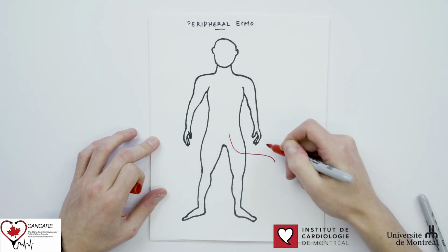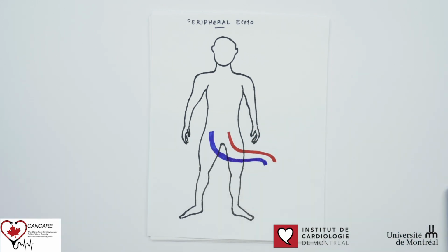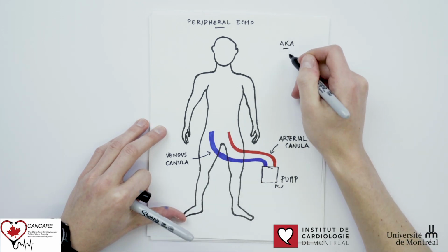Today we'll discuss differential hypoxemia. Before going any further, let's first review what differential hypoxemia is and how it can occur. Differential hypoxemia is a complication that can occur following the installation of peripheral extracorporeal membrane oxygenation, also known as ECMO, in patients with concomitant heart and lung failure.